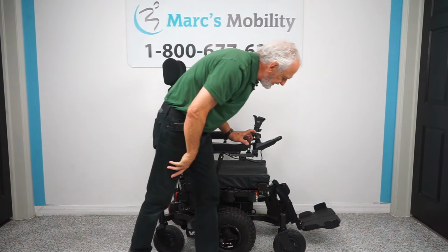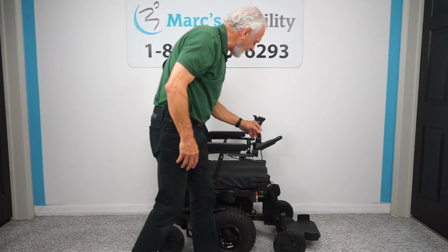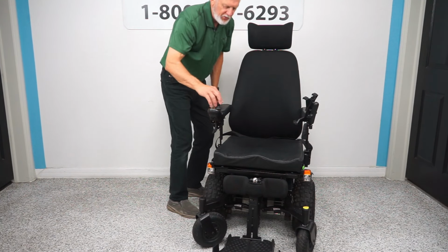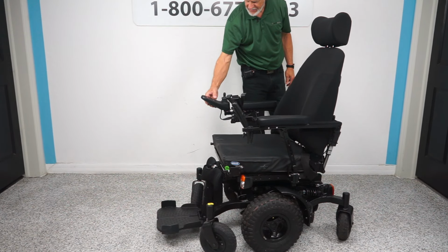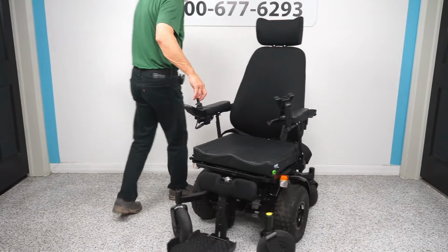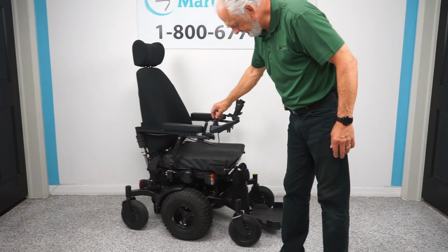So when you're outside, leave those legs out a little bit, just like that. If you're in the house, you're going to want them all the way in, because in the house you're going to want to be able to turn a circle like this. Whoa, let's turn that baby down. Now let's make it faster. So you can use it in the house, even though it's an extreme chair. Most people are going to be outside kicking dust out with it.